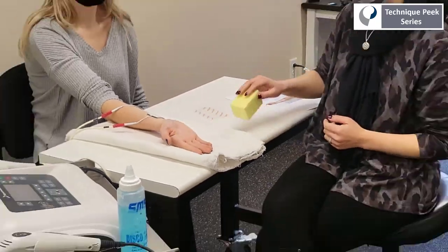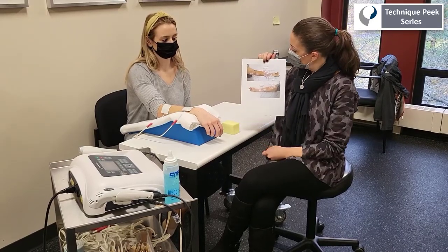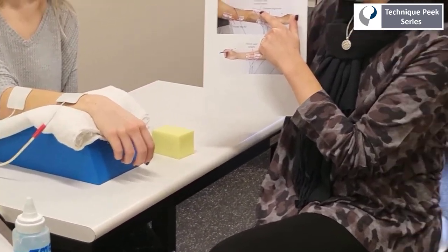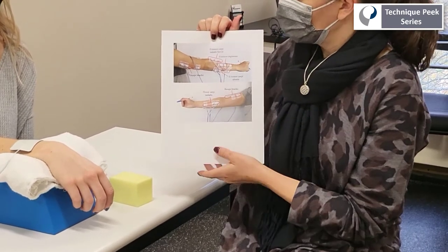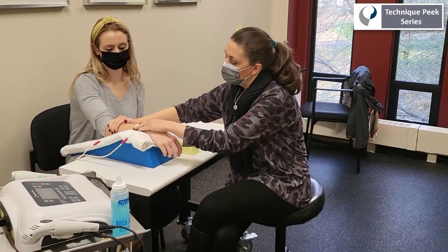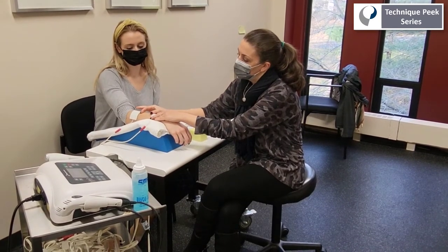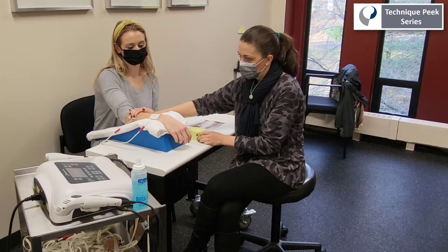This is really good for differential tendon glide. Now for bigger muscles that are more easily palpated, like your extensors, we can use a motor point chart to place our active electrode. In this example, we're targeting the ECRB tendon to facilitate wrist extension. This could be used for a patient who might be recovering from a radial nerve palsy. We can also use the sponge in this example to grasp with wrist extension to attempt to strengthen that tenodesis grasp.